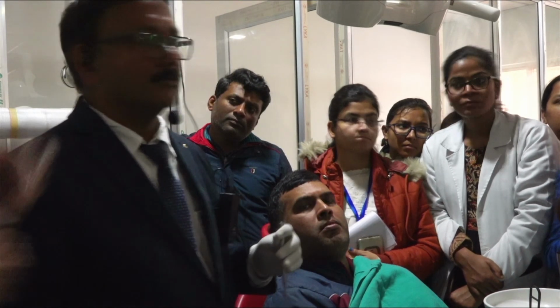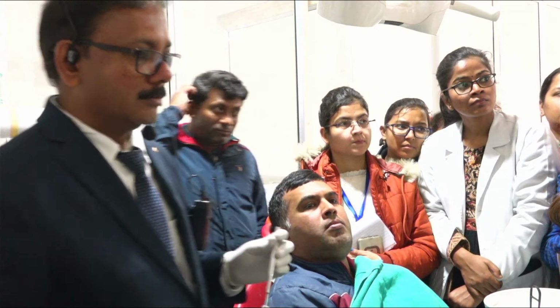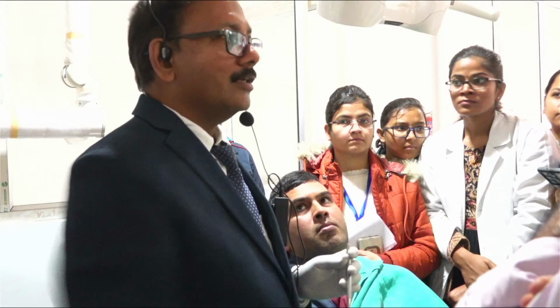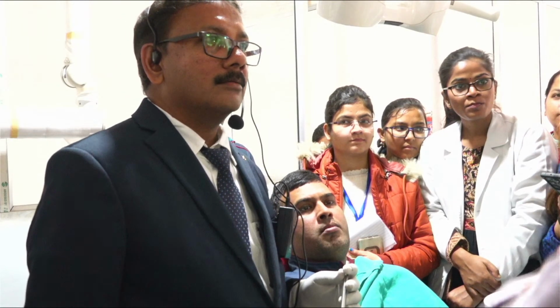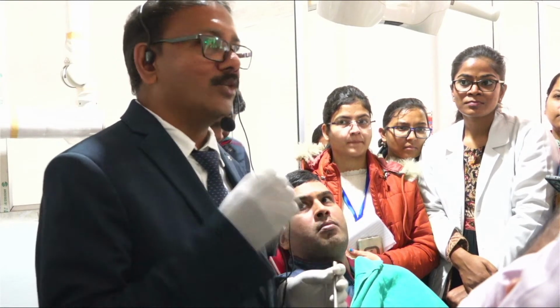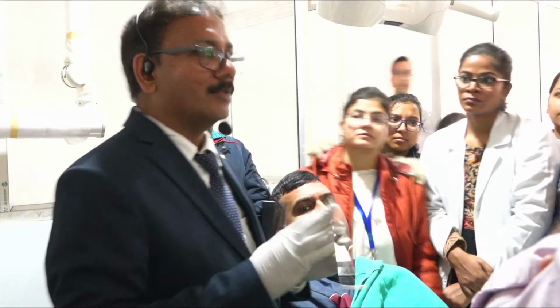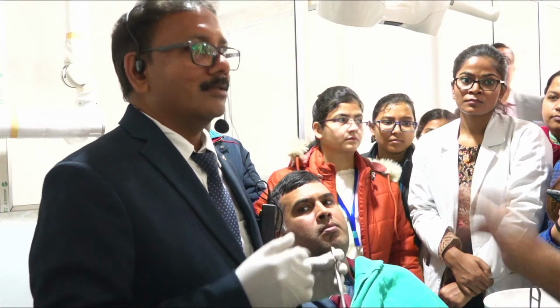Exactly. So, direct GIC filling can be done. Yes. Try it, absolutely. Without using a burr, we can debride the cavity and put the GIC. You can use the Er:YAG laser for that, because the depth of penetration of the Er:YAG laser is only 0.5 microns or 5 microns. So there is no way that you can expose the pulp, but that will cost around 25 to 30 lakhs. There will not be any problem.